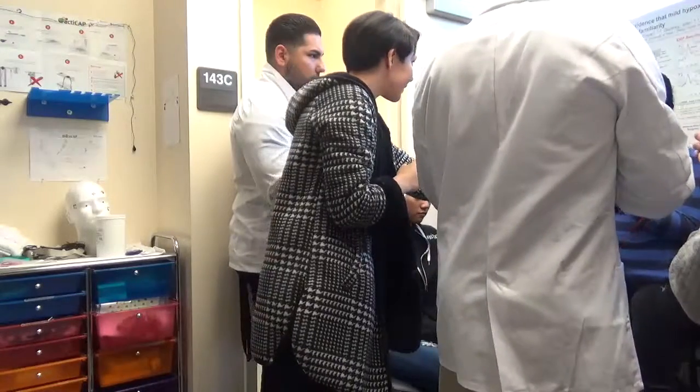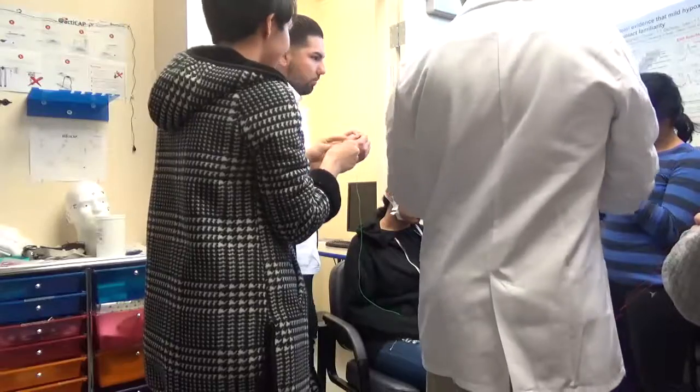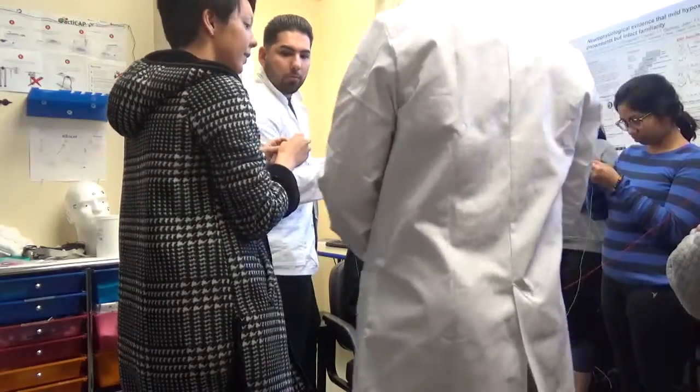Does it matter what color, or are they all the same color? They're all the same. And if you're lined up, you can put it basically there. Do you want the gel in it?